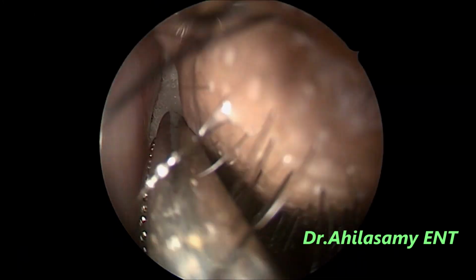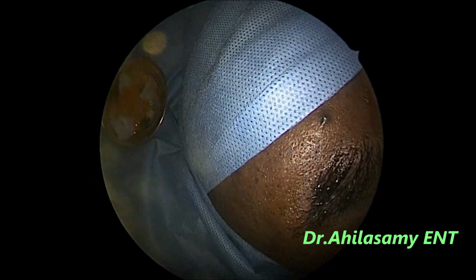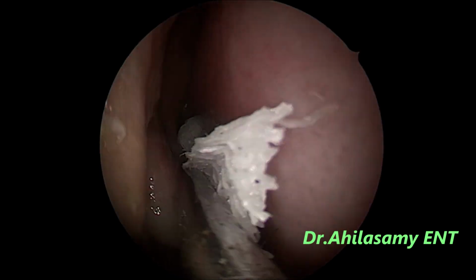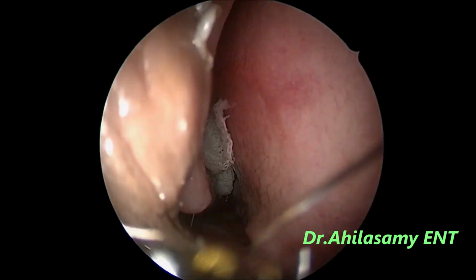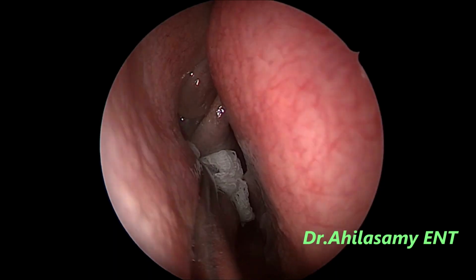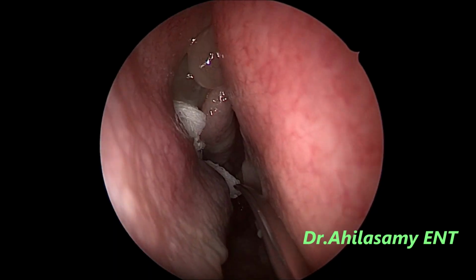Again, repeatedly pack to get a good decongestion with a solution of 4% lignocaine and adrenaline in the ratio of 1:1. With moderate sedation, good packing and good blocks, you can comfortably operate, and the patient will be very comfortable and thankful to you under local anesthesia.